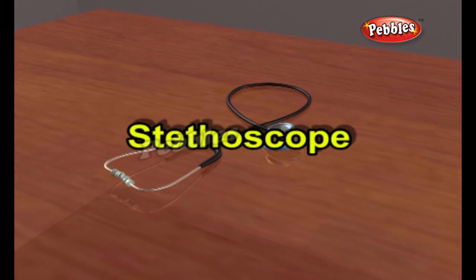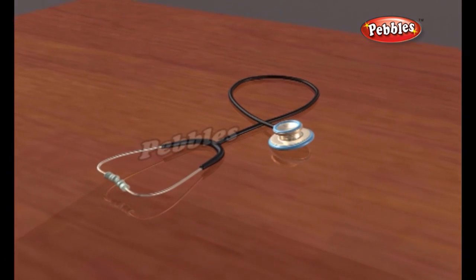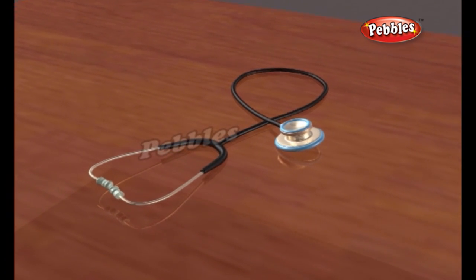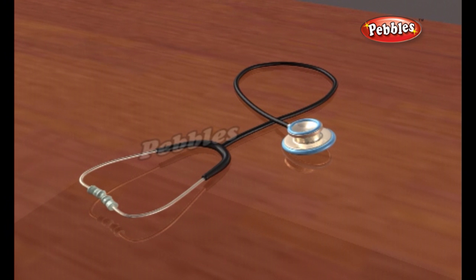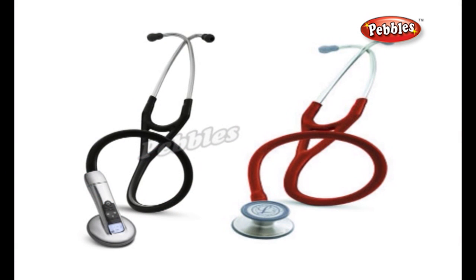A stethoscope is a medical instrument used to listen to sounds produced in the body. It is most often used to hear heart sounds and breathing. It is also used to listen to intestines and blood flow in arteries and veins. The stethoscope was invented in France in 1816 by physician René Laennec.